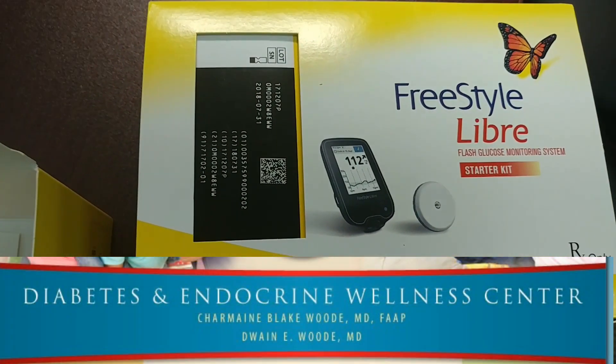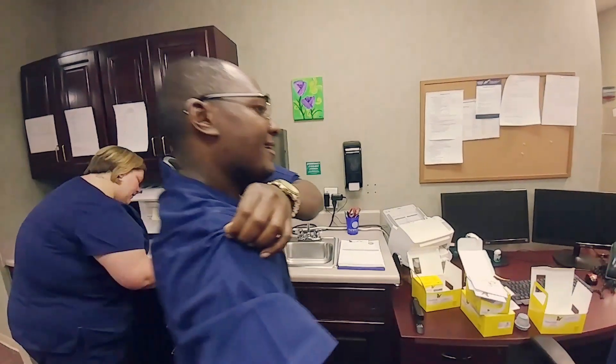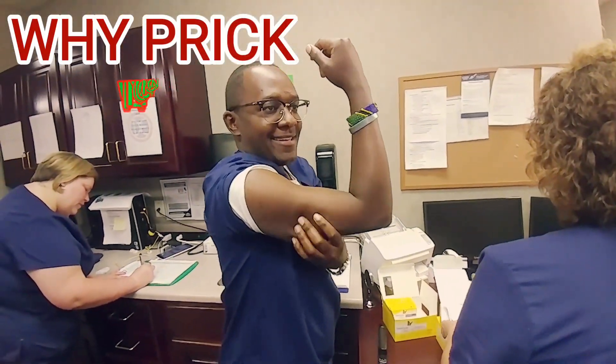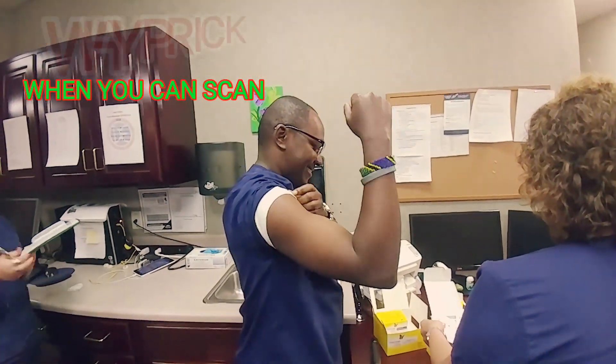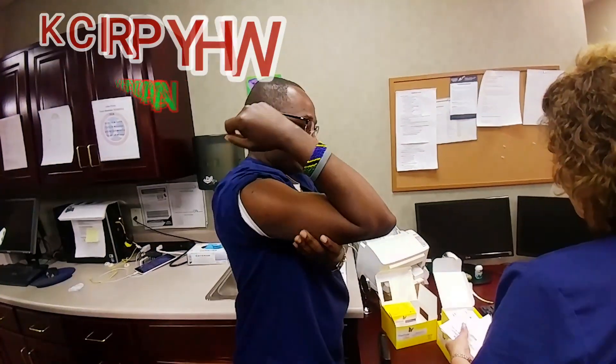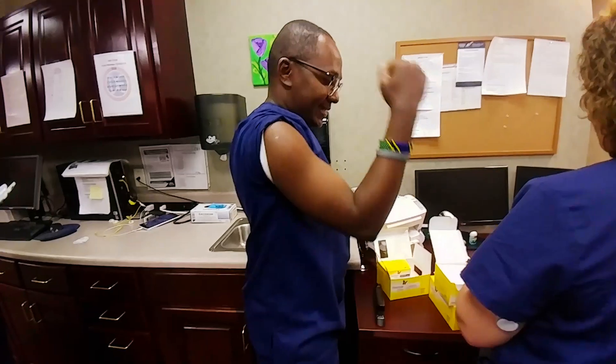What's going on? We're putting on CGMs. Now we're going to be walking around. This is Sabas putting on a personal CGM. Everybody else will put one on now except for Jennifer and Cassandra. CGMs are recorded every five minutes.